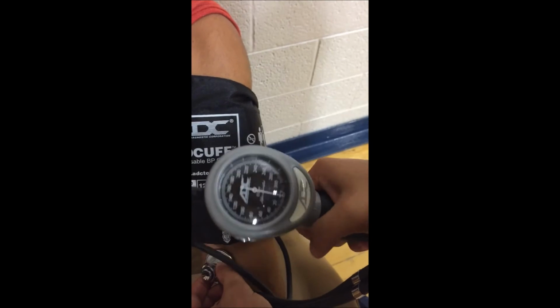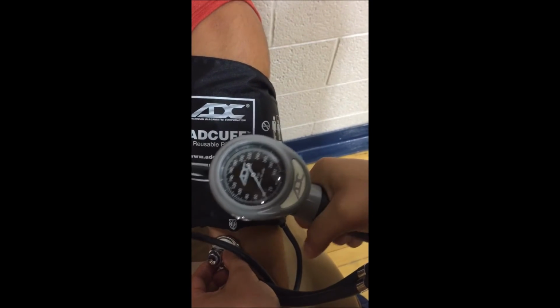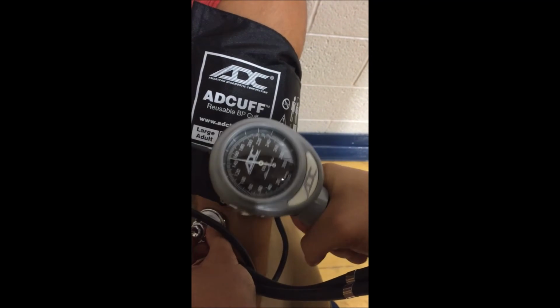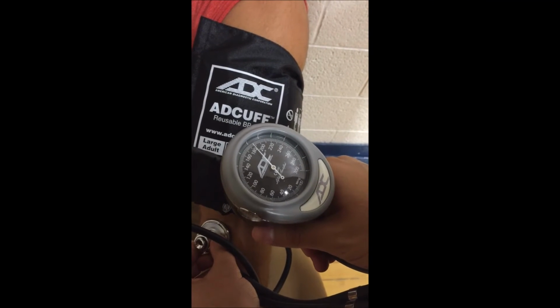With the valve tightened and the bulb in your hand, pump the bulb to inflate the cuff. If working with a new patient, inflate the cuff to 180 to 200 millimeters of mercury. If not, inflate to 20 millimeters of mercury above the first Korotkoff sound.